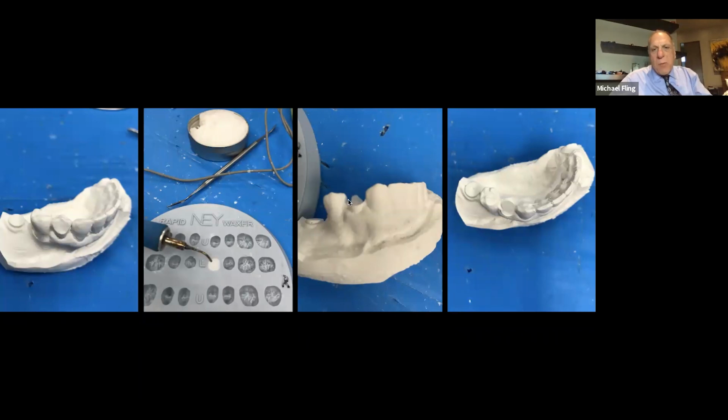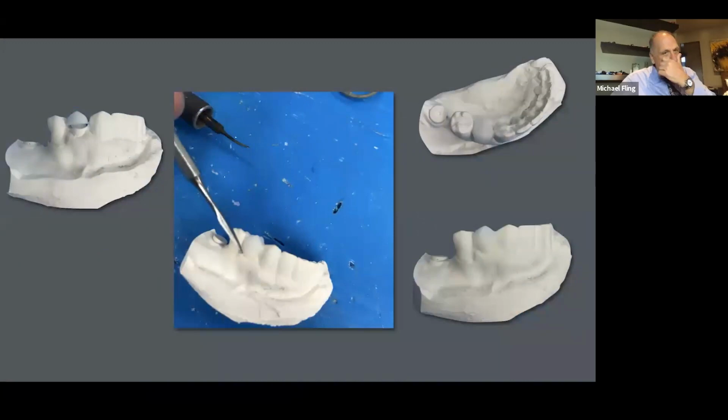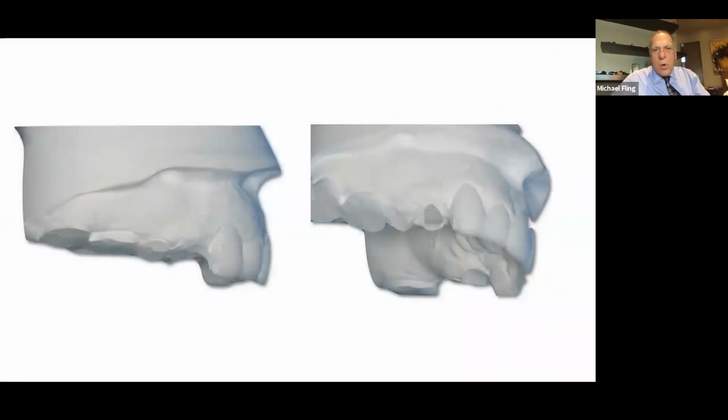Here you see the little piece of rope wax that I put, and then you simply set the tooth on there, and then you complete your wax up. Okay. Let's see what we can do. There we go. So here you see me setting the tooth on here, and then I just add wax in here to create my axial contour. So literally in just a matter of a minute or two, I can wax a back tooth. So it just makes it really, really quick.